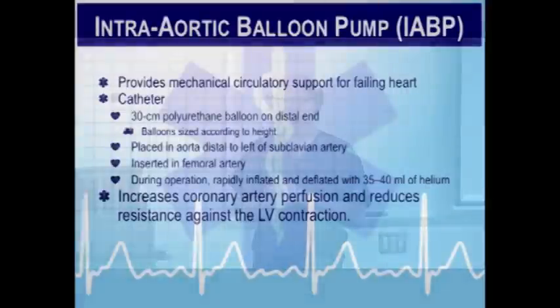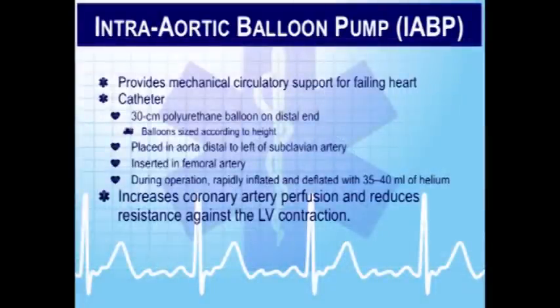Balloon pumps do two things, and two things only, and don't let anyone tell you otherwise. They increase coronary artery perfusion, and they decrease afterload. So now you know what afterload is, right? Specifically, the afterload that it's decreasing is it's lowering the diastolic blood pressure.